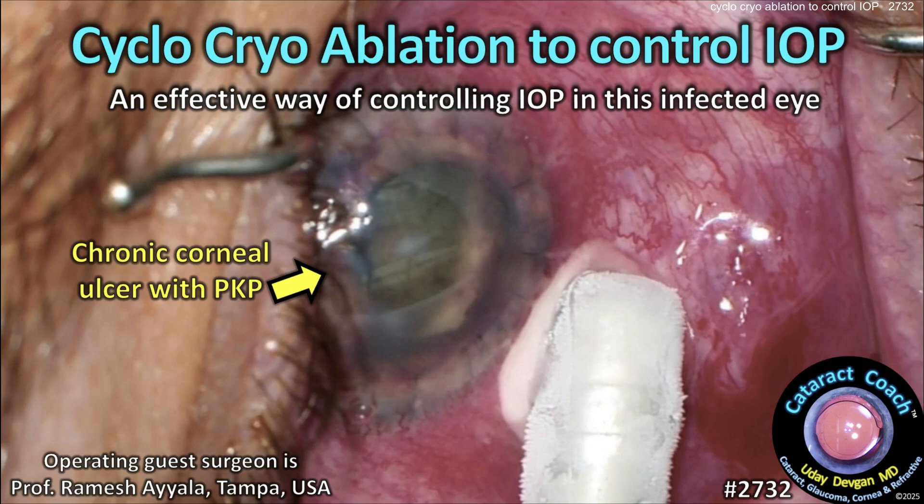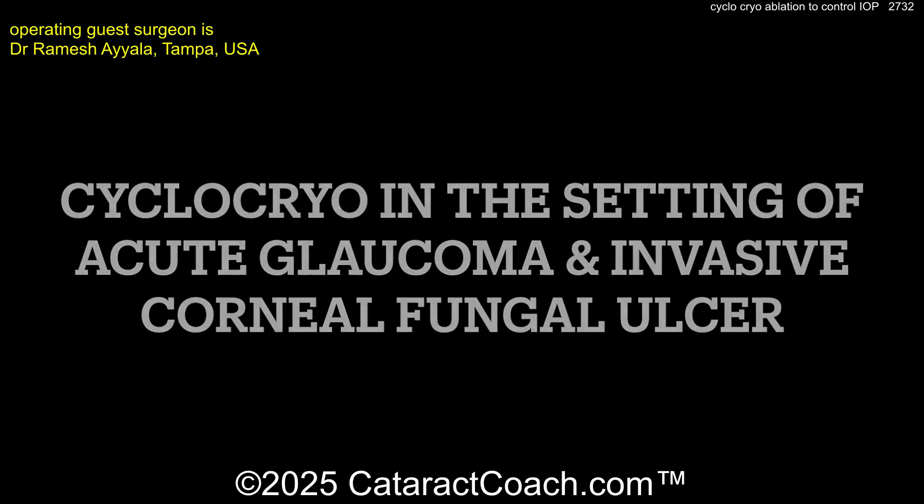CataractCoach.com. Cyclocryoablation to control intraocular pressure. This is a very effective way of controlling the IOP in this infected eye. This is cyclocryo in the setting of acute glaucoma and invasive fungal infection.